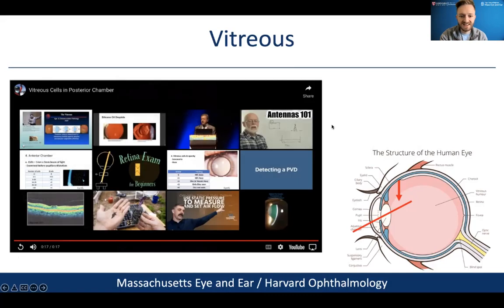I didn't choose the music there, but what you could see was the white floating substance was probably white blood cells floating in the vitreous of the patient. And if you focus far enough back, you can find those types of things inside of an eye.